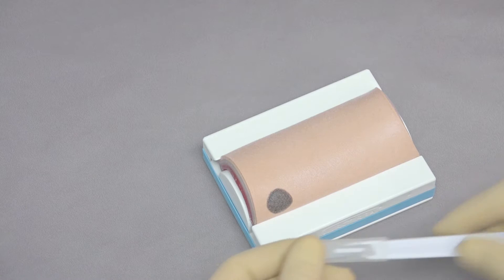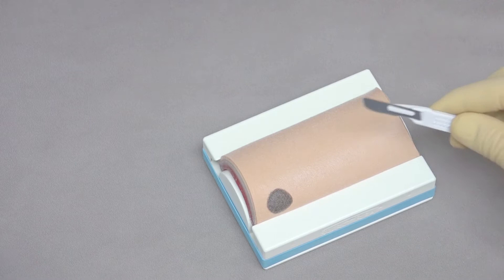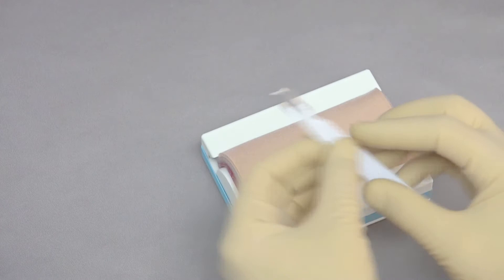To begin suturing, we first have to make an incision. Take the scalpel blade and carefully remove the cap so you don't cut yourself. Generally, if you're right-handed, your incision will go from left to right. If you're left-handed, the incision would go from right to left.